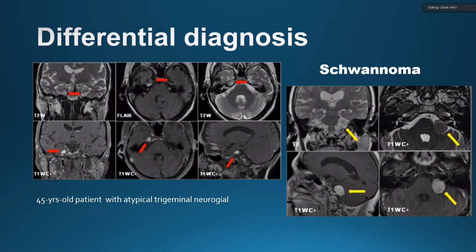Yes. Yeah. And do you have a case which shows the neurovascular conflict on the fusion image? Do you have a clinical case which shows the neurovascular conflict? Okay. So we ask the technician to make the sequence that fuses these two sequences. Yeah. You can do it yourself, or the technician can do it for you.